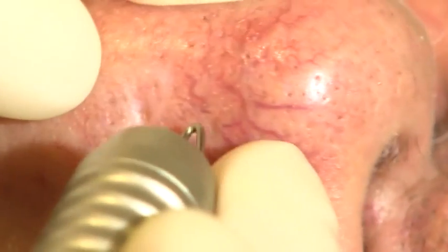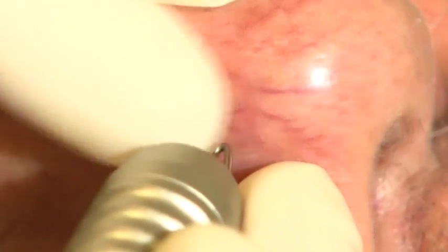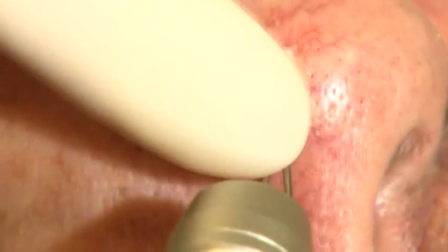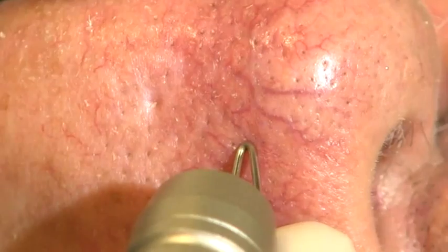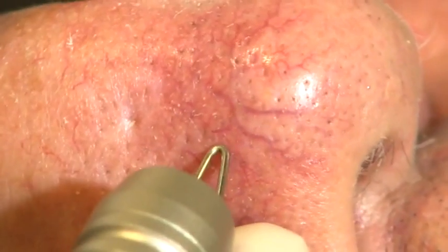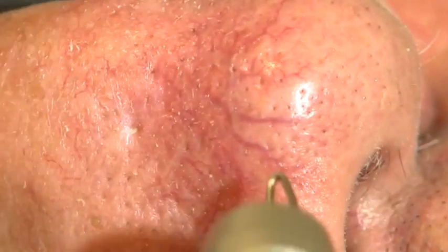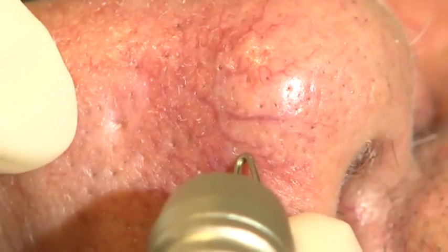Note that the handpiece spacer acts as a guide to maintaining the lens at an accurate distance from the skin, thereby maintaining the spot size. It is also desirable to keep the handpiece as perpendicular as possible to the skin surface. To perfect the vessel tracing technique, the operator should watch the laser spot on the skin rather than looking at the spacer tip. Here we see an example of optimal energy selection.